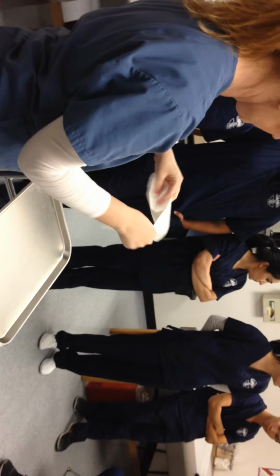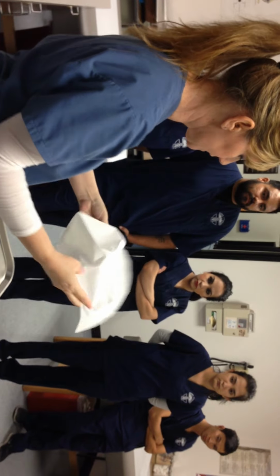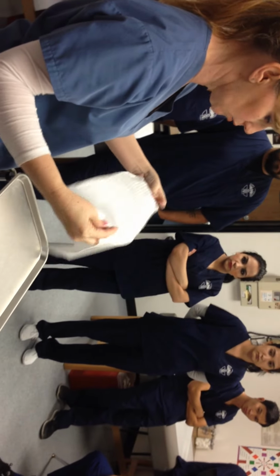Now we need our tidy towels, and they're right here in the little desks here. And you're going to see your tidy towel has two sides. One side is absorbent. You see that? The other side is shiny. Why? Because we don't want whatever gets on this to leak through onto the tray. So you put the shiny side down.